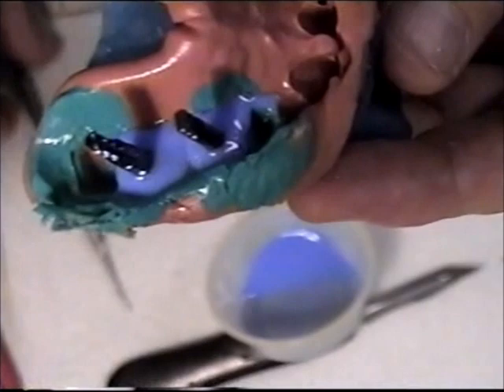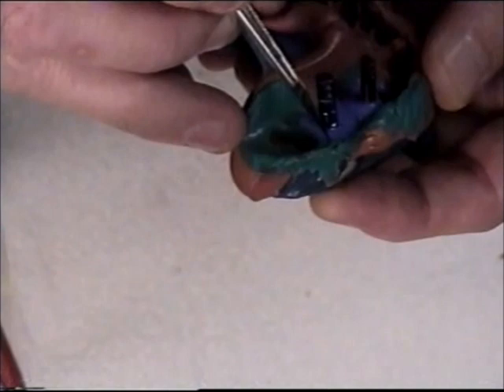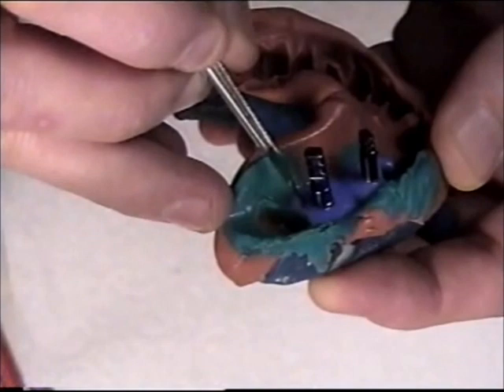Okay, my soft tissue material is hard now, or as hard as it's going to get, and it's going to allow me to be able to use my surgical blade here to cut it apart, or to section it. So I'm going to make a little cut right next to the adjacent tooth.